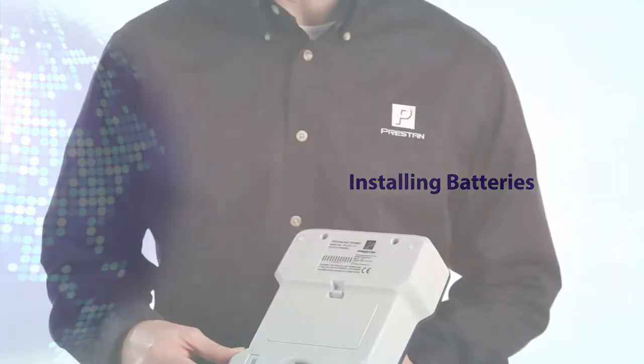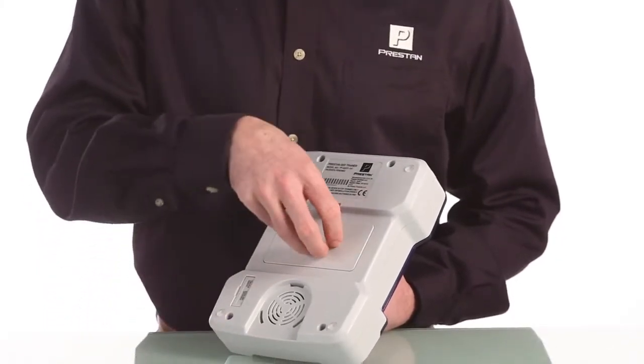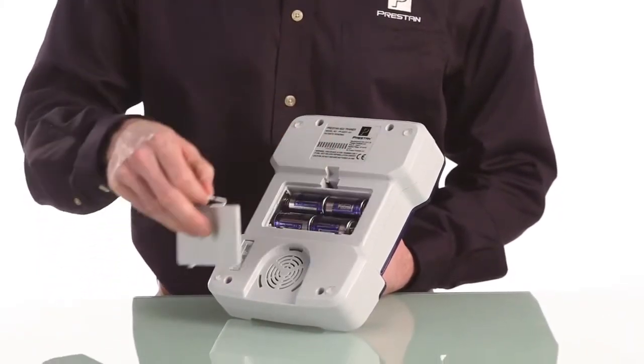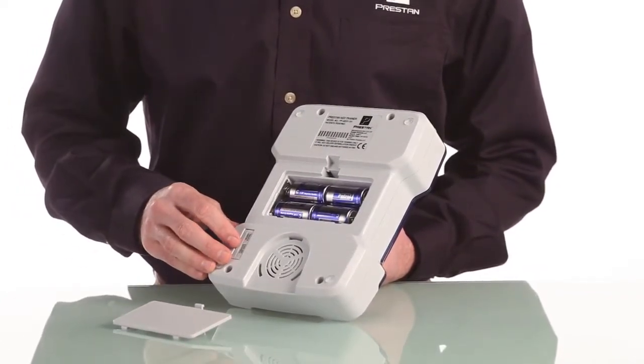Let's start with the back of the AED Trainer. This is where the battery compartment is located, and as you can see the AED Trainer is powered by four standard C batteries, which are in the unit when it is shipped to you.